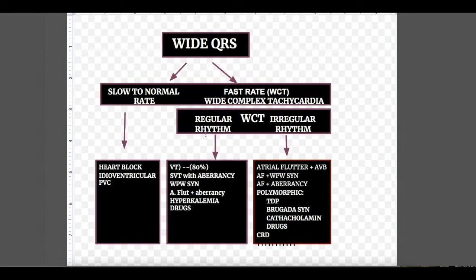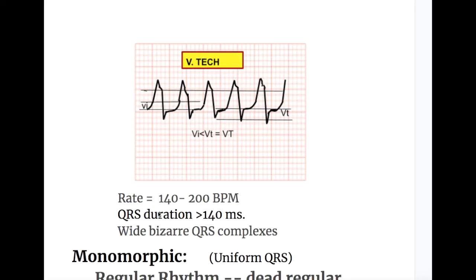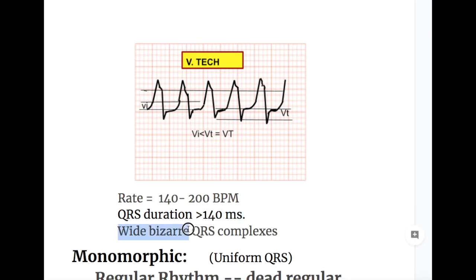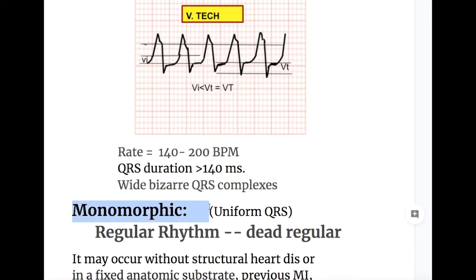The most common cause of regular rhythm wide complex tachycardia is ventricular tachycardia. In VT, the rate usually ranges from 140 to 200 beats per minute, and QRS duration is usually more than 140 milliseconds. QRS complexes are wide and bizarre. The rhythm may be regular or irregular, although regular is more common, and regular VT is monomorphic with uniform QRS complexes.